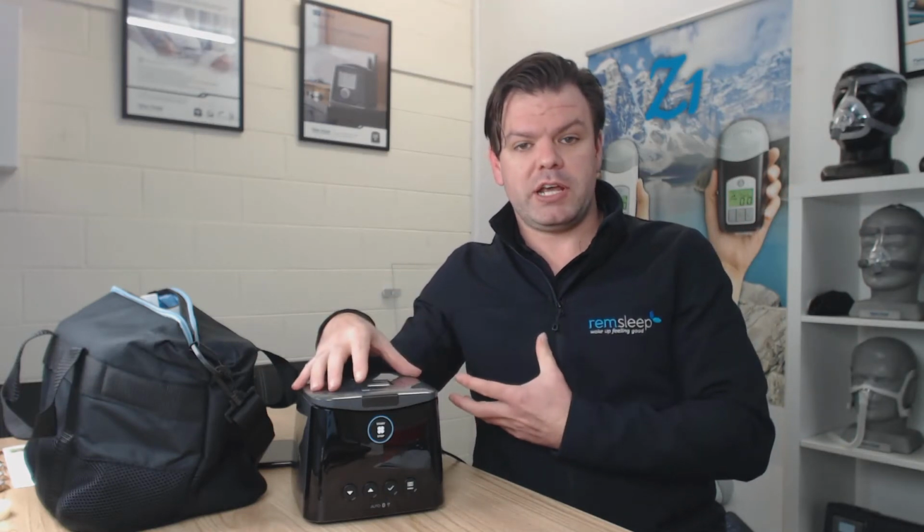And then the last one is great tech, all right? You do need some really good technology in there, especially in this day and age, so that you can keep track of what the machine's actually doing. It might not matter to some people, but for a lot of people, especially clinicians as well, and for a lot of patients these days, they want to know what the machine's doing. Is it treating their sleep apnea? Do things need to change? All right. So that's important. So four key things there, and we'll go through them in a little bit more detail.